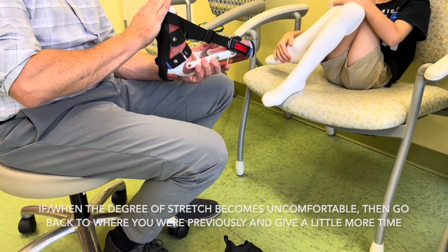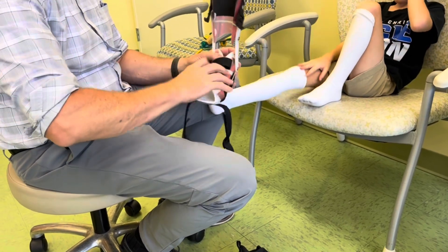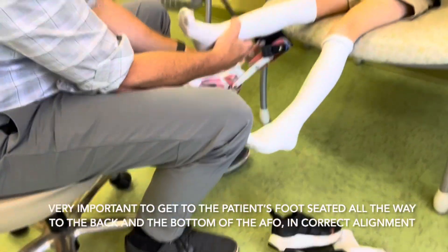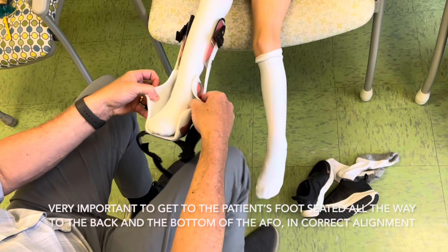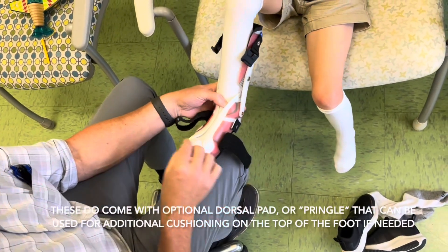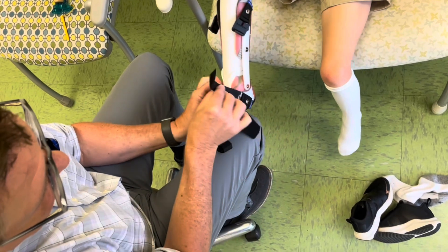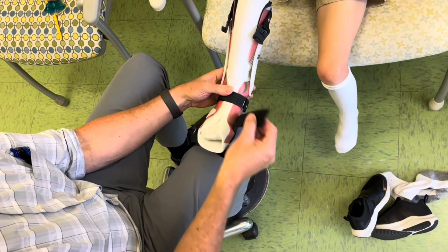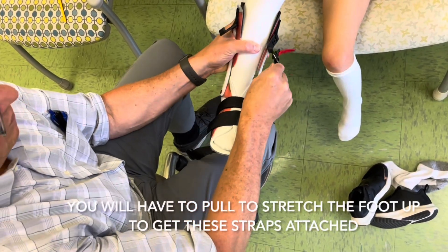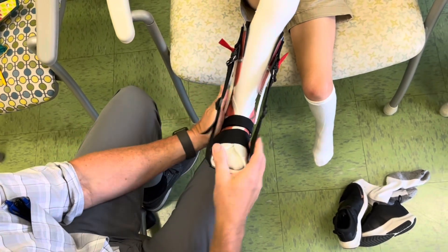We're always trying to get just a few more degrees of movement if possible. To put it on, disconnect these stretching straps first and make sure the foot is properly seated all the way down. Push this part back out of the way, come behind the leg — this one's for the right foot — and use both hands to open it up and scoop the foot in. Bend the knee; that's the best way to get the muscles to relax so the heel goes all the way down to the bottom, which is important. There's a mark on the ankle strap too — when it goes through, line it up with the silver mark. Then attach the stretching straps; they snap right into place.